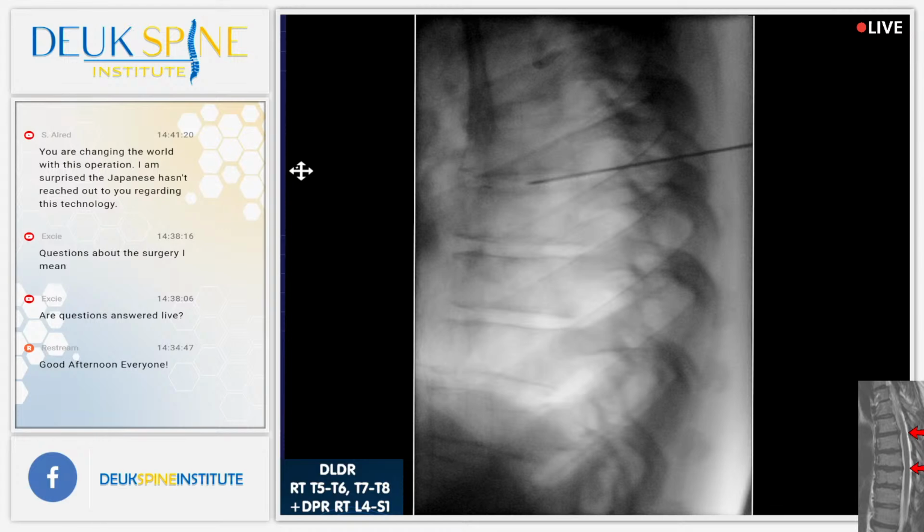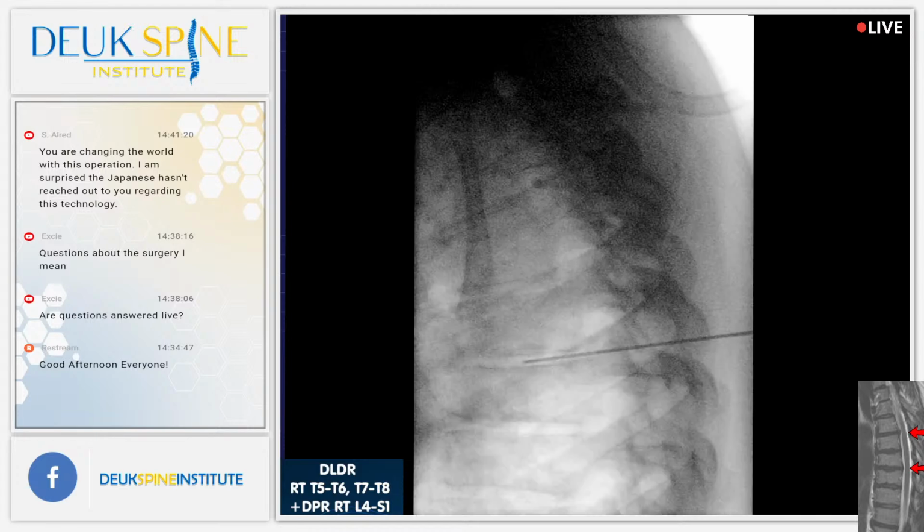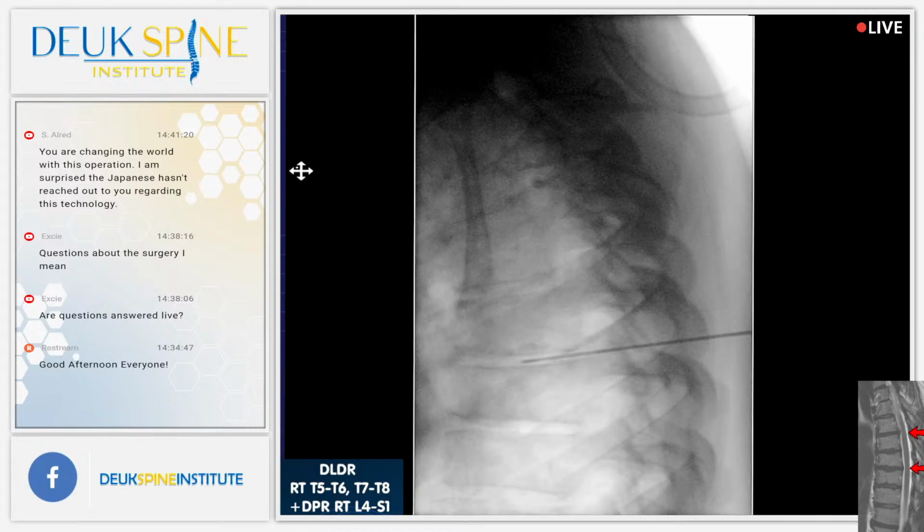Now, since you're awake and helping me here, would you say you could feel that spot pretty well, right? You can feel that it comes from that area in your back where you're hurting, right? Where are you feeling it? Are you understanding me? Yeah. Where are you feeling it? All right, that's good. We're fine. I'm going to give her some more numbing medicine.